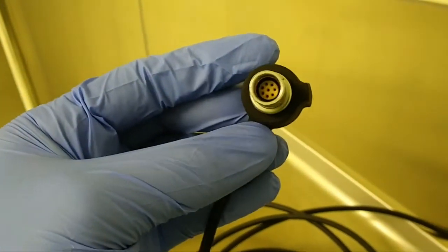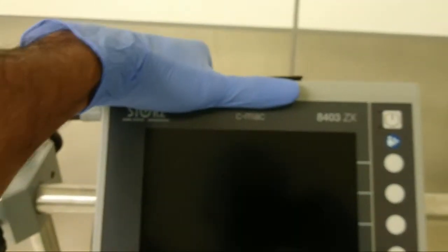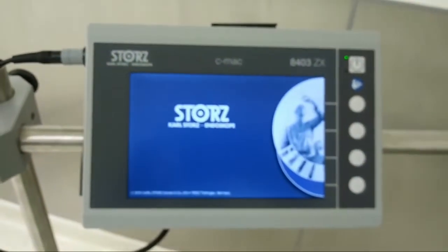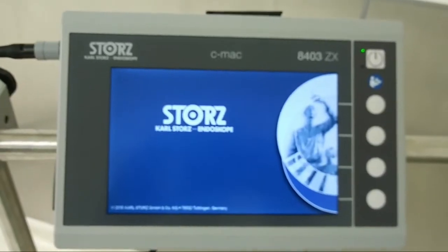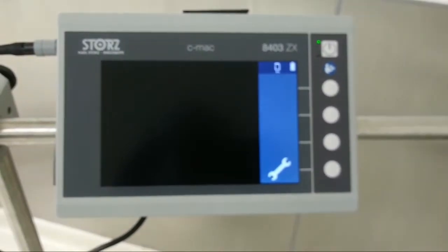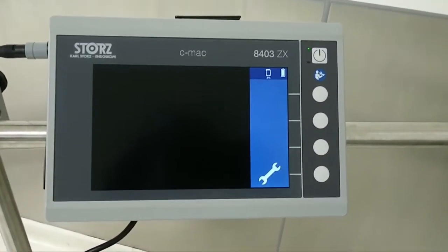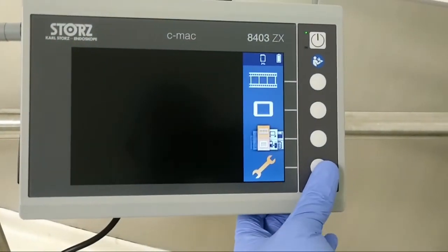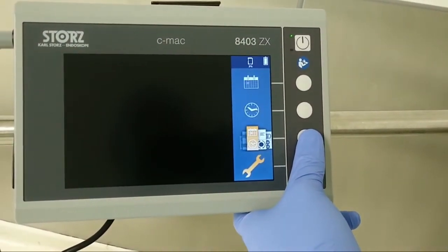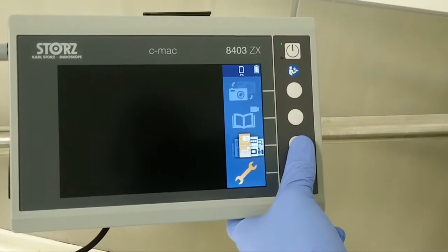Capture and other activities like that. The quality of the picture is a key feature of this equipment. First, we attach the cable to the laryngoscope, and we should confirm that there is minimum battery backup before each procedure. First, we switch on and open the screen and we can see it like that. We have three options. One is settings, and we can see the memory and battery status also.